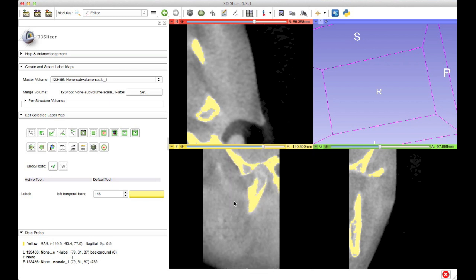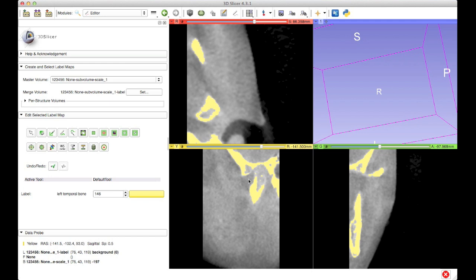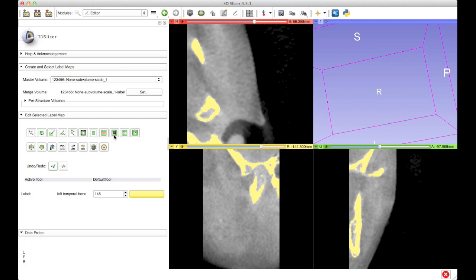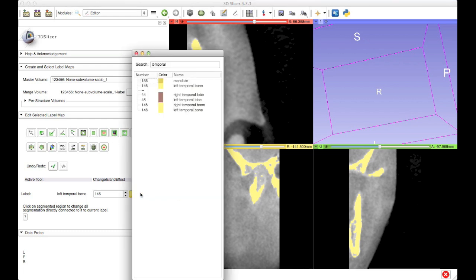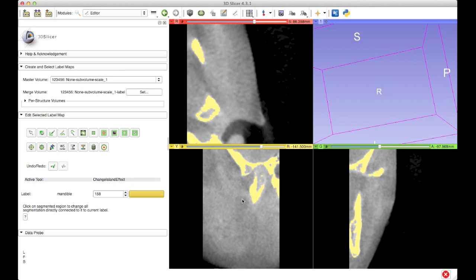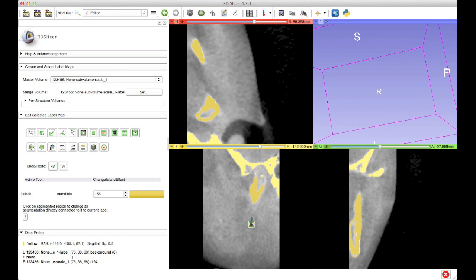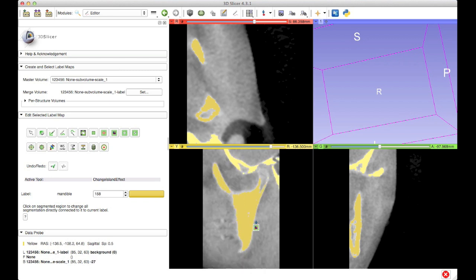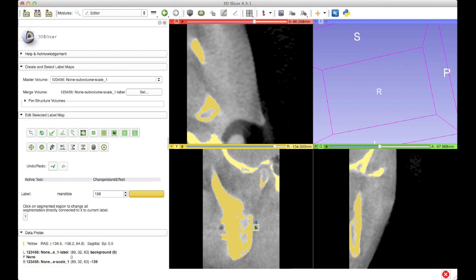When I do that, the flashing of that label map has stopped, so I've created a segmentation of the bone. But right now all of the bone is delineated as label 146, and clearly it's not all part of the temporal bone. So what I'm going to do now is change it such that the lower, mandibular side of the TMJ has a separate label. I'm going to do that by using the change island effect — it basically allows me to click on a region and change all of the areas directly connected to it to a different label. I'm going to choose the label value specific to the mandible by clicking on the color swatch and searching for mandible, then picking label 158. Now I have the appropriate label, so I'm going to click anywhere within the lower part of the TMJ. Now I have a label map in which the top part of the TMJ is label 146 for the temporal bone, and the inferior side is label 158 for the mandible.